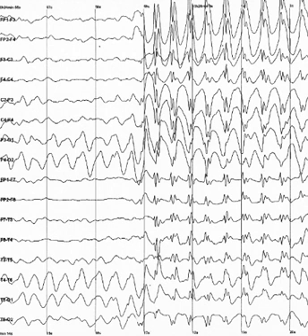Other methods of looking at brain activity, such as PET and fMRI, have time resolution between seconds and minutes. EEG measures the brain's electrical activity directly, while other methods record changes in blood flow, e.g., SPECT, fMRI, or metabolic activity, e.g., PET, NIRS, which are indirect markers of brain electrical activity. EEG can be used simultaneously with fMRI so the high temporal resolution data can be recorded at the same time as high spatial resolution data. However, since the data derived from each occurs over a different time course, the data sets do not necessarily represent exactly the same brain activity.